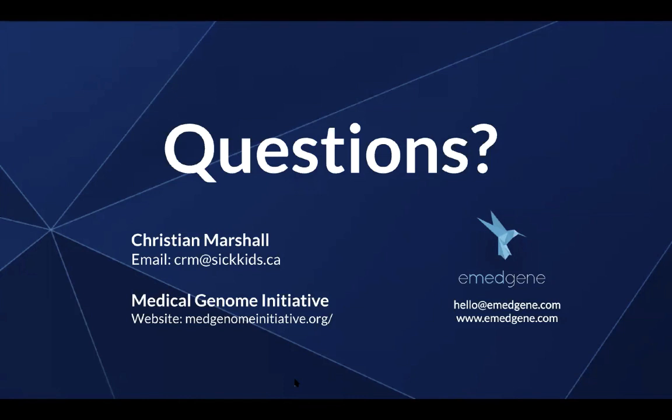Yeah, so it's another great question. I didn't have time to get too much into it, but one of the issues that we've had in the past that I touched on is that for small variant calling right now, GATK is a very good program. It works really well. But at least in our analysis that we've done recently for the small variants, we found Dragon to perform very well, especially for indel calling, and to outperform it. So we wanted to make that switch. It's also very fast as well. So we felt like it was something that we wanted to switch to. I think our biggest challenge was trying to figure out how to do the CNV calling.